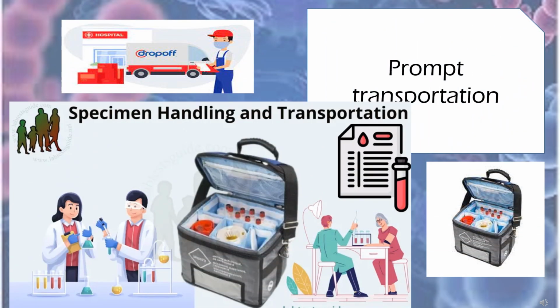Lab specimens should be transported to the lab as soon as possible after collection to prevent delays in testing. Delays can change the values of the analytes being measured.